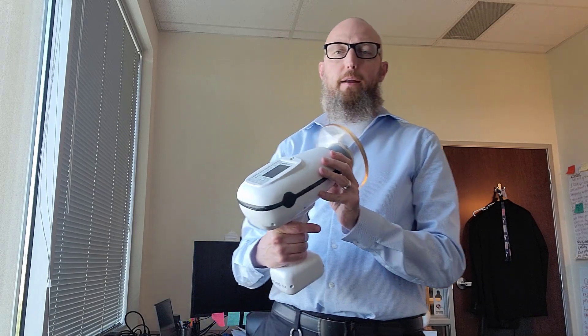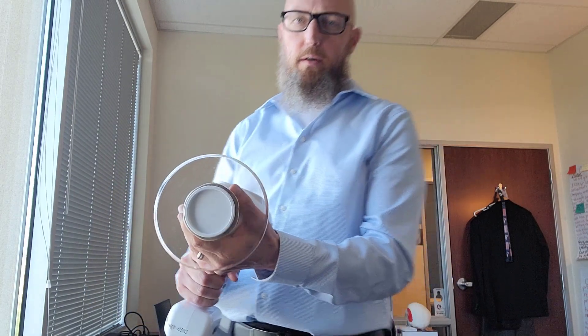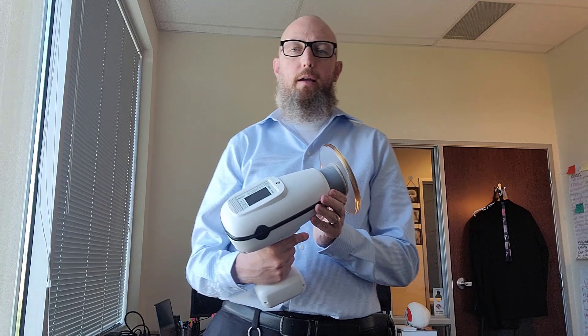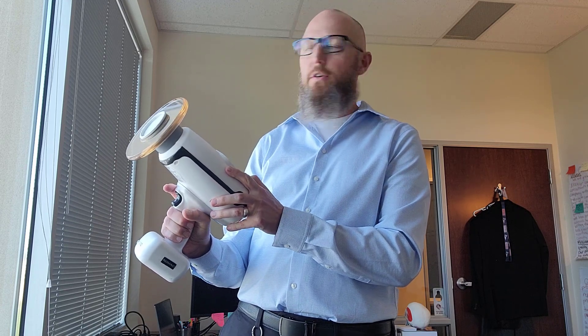So I got the CAVO Nomad handheld x-ray unit here. This recently got back from repair because it's used in our student dental clinic and of course it's going to be dropped once in a while. So it was not working at all, it went in for repair. When we got it back, the settings were set back to the factory settings which are really low.